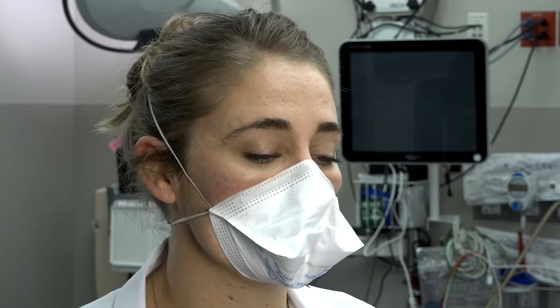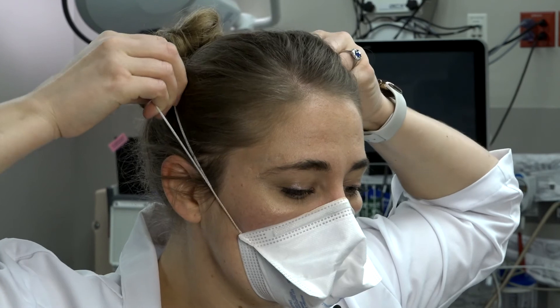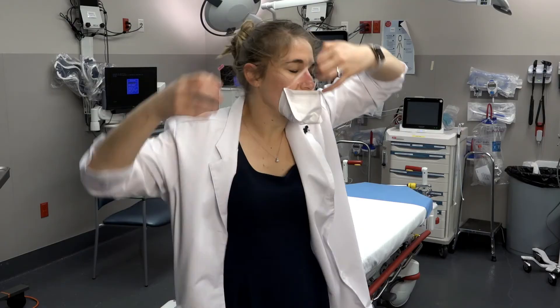When you are done wearing the respirator, you will remove it handling by the head loops only, pulling the mask away from your face and discarding it. Don't forget to perform your hand hygiene after you remove it.